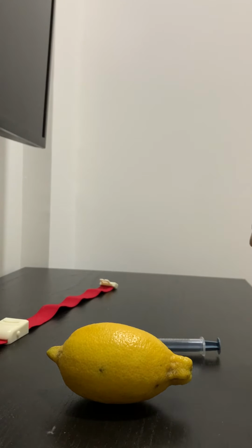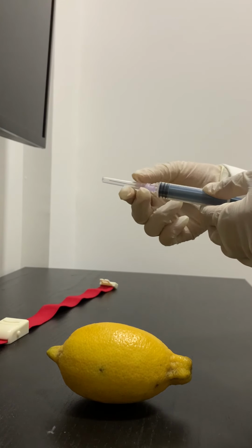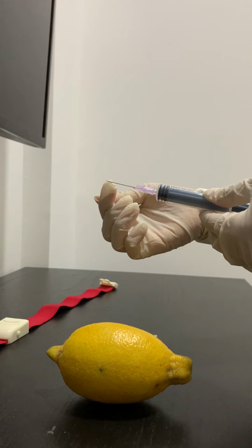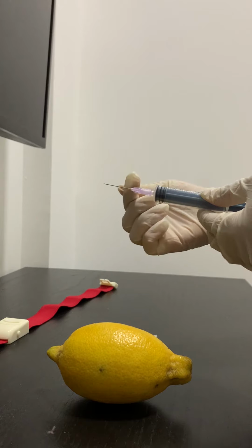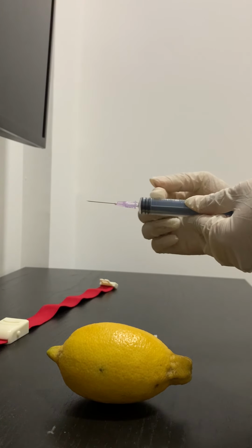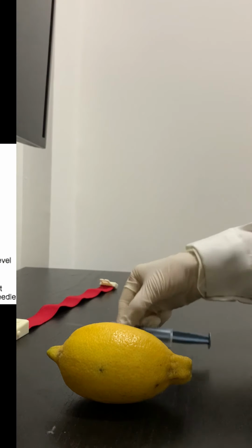Now I'm going to show you the parts of a syringe and needle. This is the syringe and this is the needle. This is a protector to cover the needle, so you can remove this. And at the tip, it is called the bevel, and this is the shaft of the needle, and this is the hub of the needle. This is the needle adapter. This is the barrel of the syringe. This is called the plunger. And that's all.